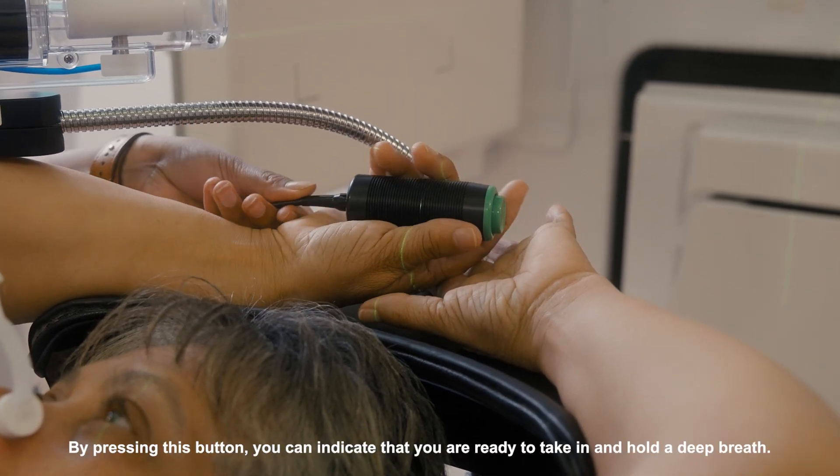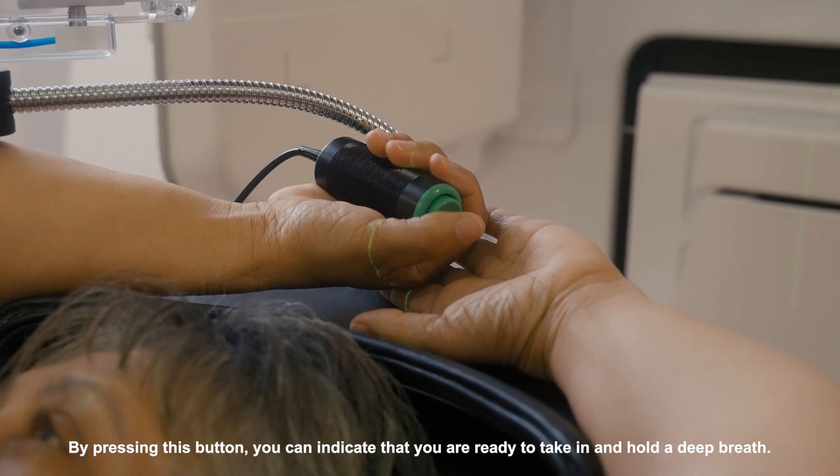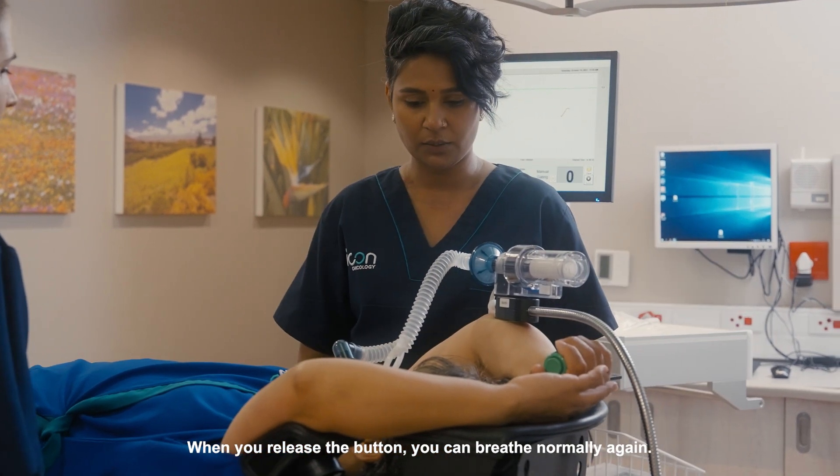You will be given a safety button. By pressing this button you can indicate that you are ready to take in and hold a deep breath. When you release the button you can breathe normally again.